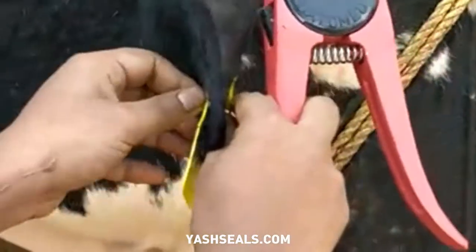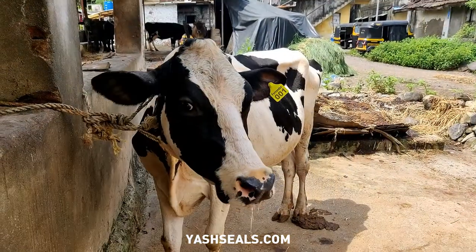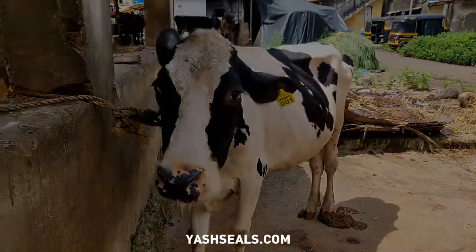Once the tag is in position, give a quarter turn to the left and right. Check the wound after some days and disinfect if necessary.